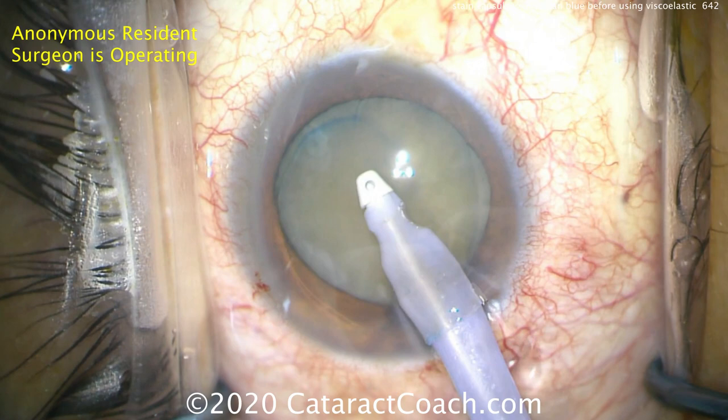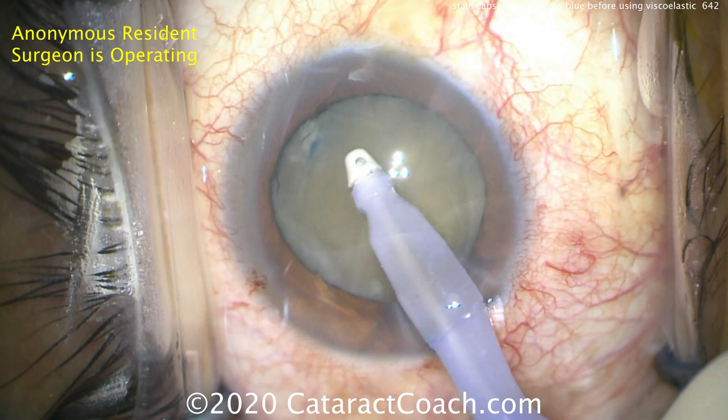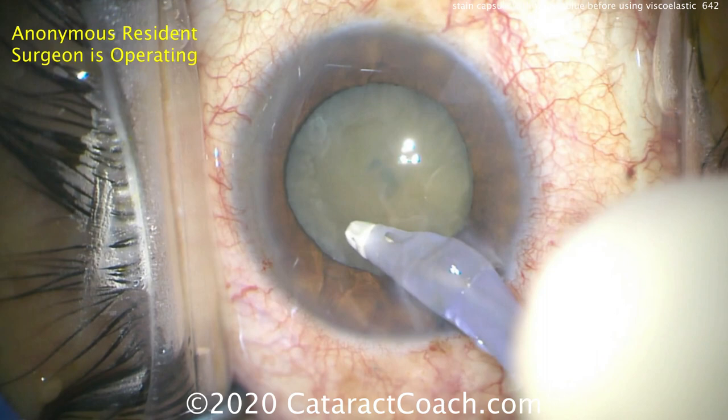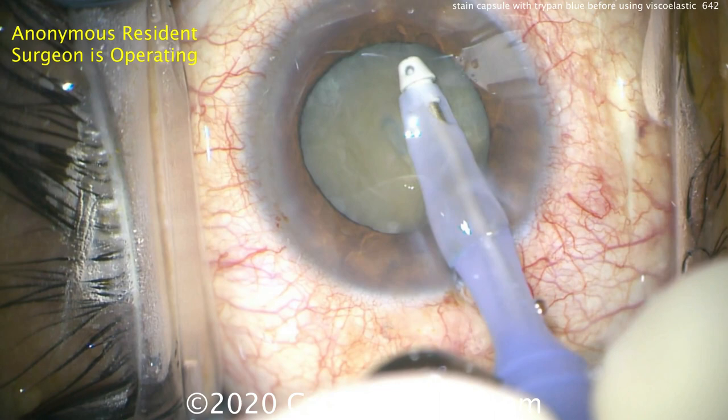So what should you do? Let's take the eye probe and remove the viscoelastic from the eye. Make sure there's no viscoelastic stuck on the anterior lens capsule, and then we'll stain it properly. This is why I recommend: for the best staining with TriPan Blue Dye, make sure you're putting the dye in before any viscoelastic. You want the dye to directly touch the anterior lens capsule.